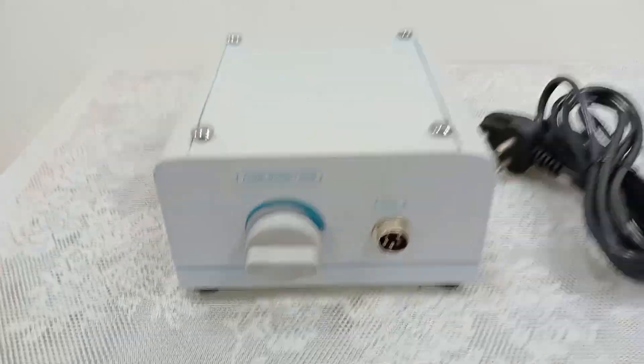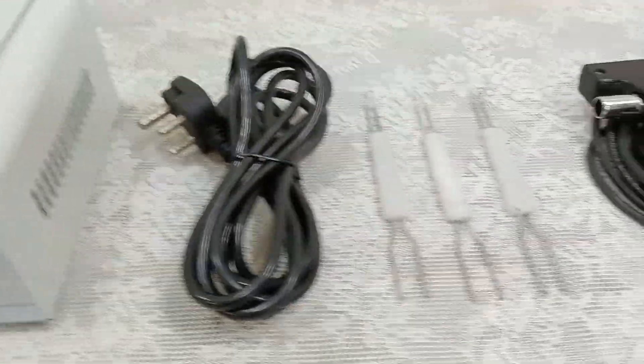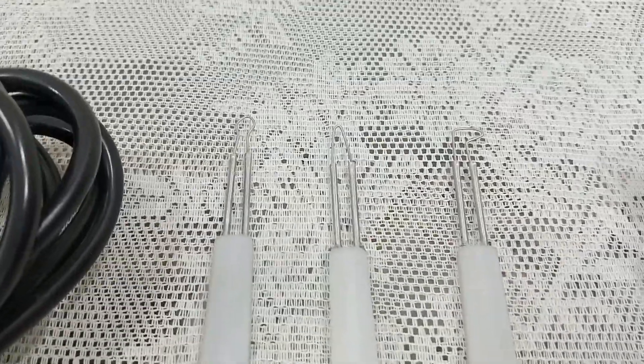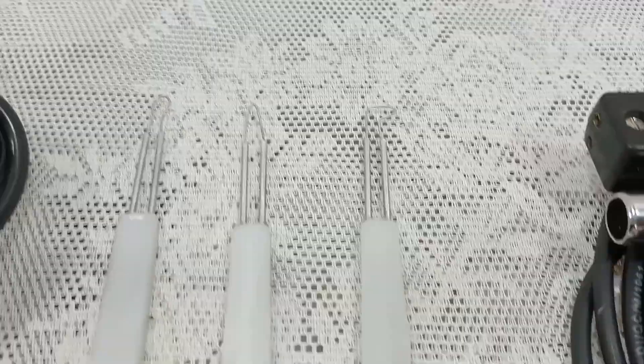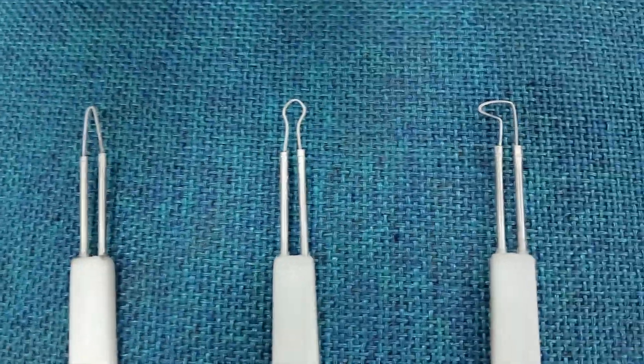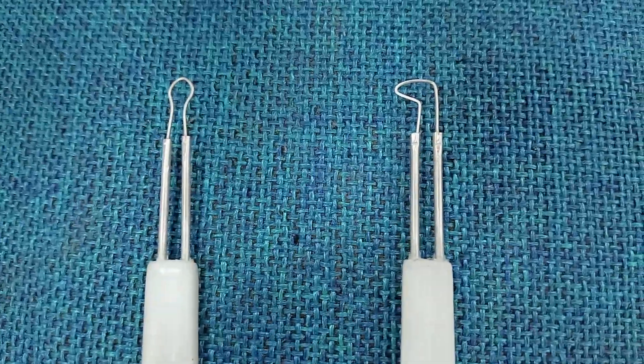In this Heflon box you will be getting a thermal cautery and a cervical cautery, along with the mains cord and the 3 electrodes. You will get a loop electrode, a straight electrode, and a curved electrode.